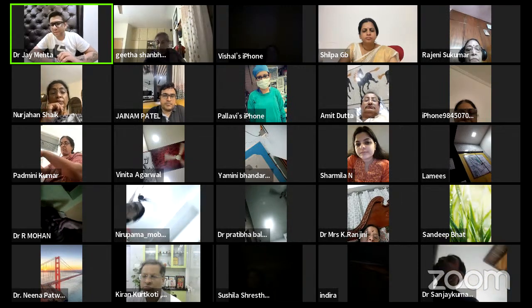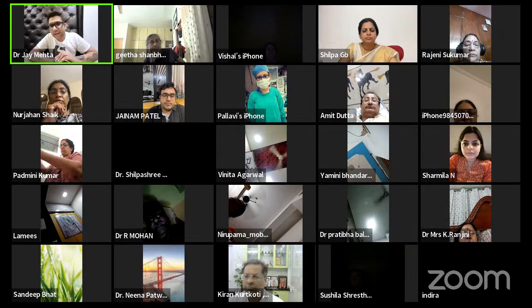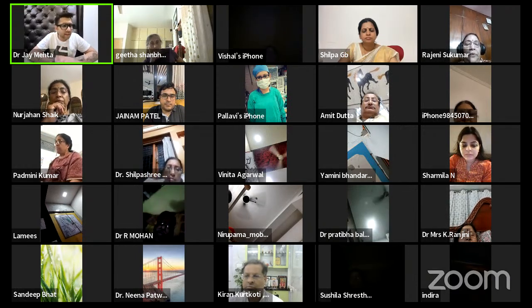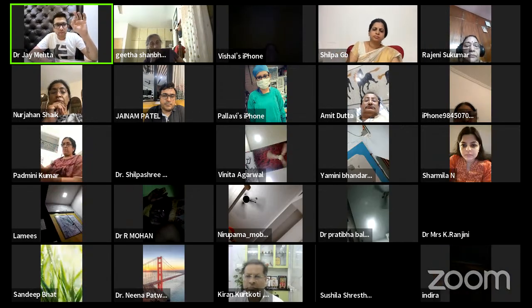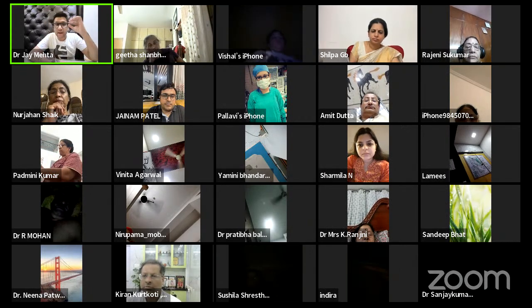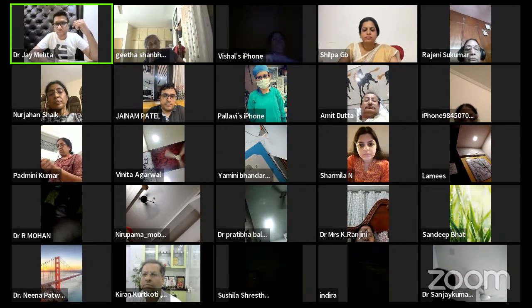Many a times, we have done a diagnostic hysteroscopy in a patient who has just finished her menses. In that situation, there is going to be some blood clot lying here or there. This particular blood clot in a diagnostic hysteroscope is going to come and obscure your vision. One of the best things you can do in a situation like this is put your pressure just below the clot. It will automatically dislodge it, even before your camera touches it. And by mistake, if it has touched your camera, then just swipe your camera along one of the lateral walls. The clot normally gets dislodged. So that is one common thing which people often ask about a diagnostic hysteroscopy.